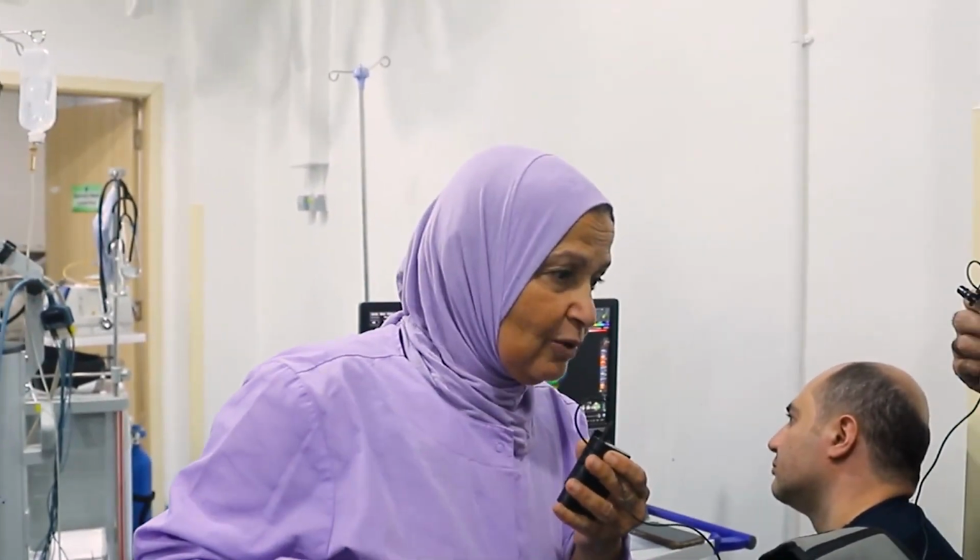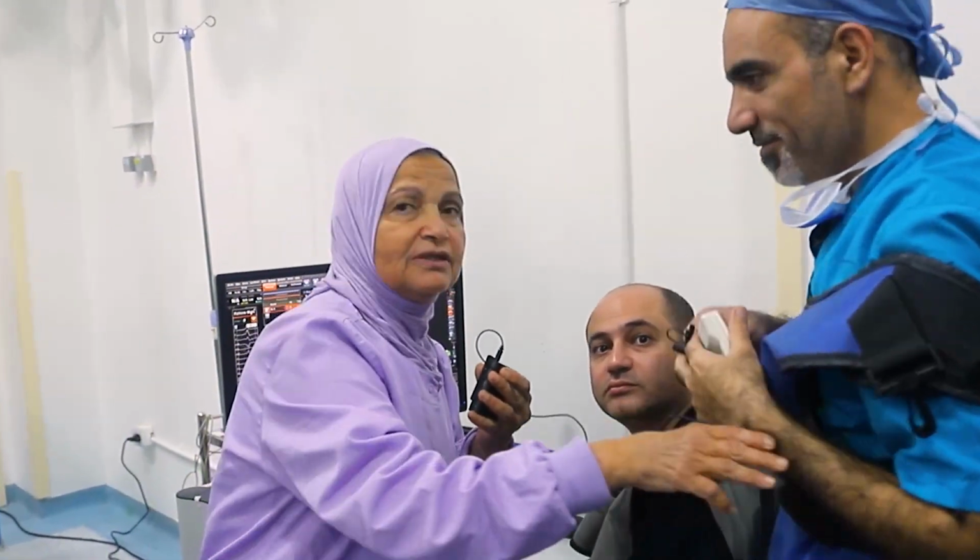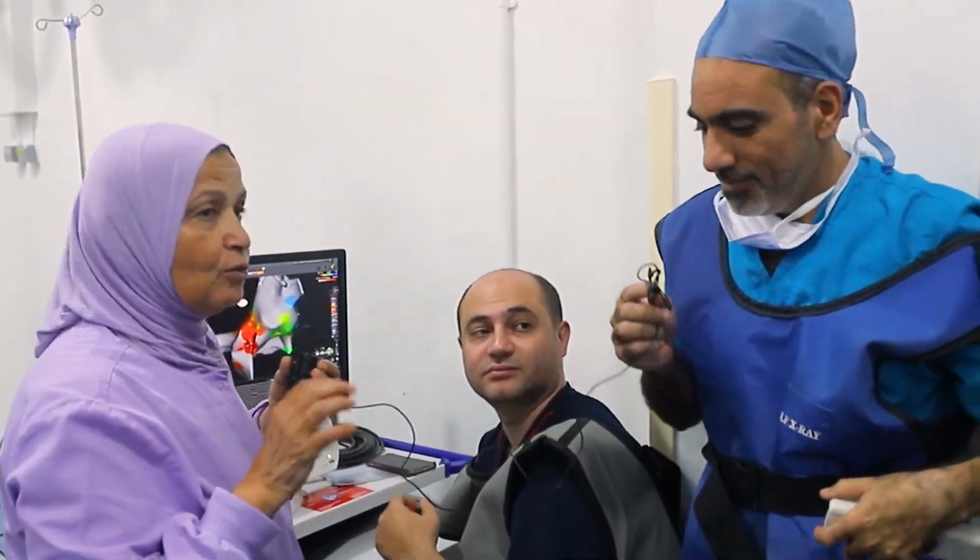Very nice. We used the carto, we used the conventional. Look here, Khalid, look here. And also we did the coronary angiogram to make sure that this segment depression is not indicating any obstruction or thrombus. If there is something, we can do intervention immediately. But alhamdulillah, it was only heat transmission.